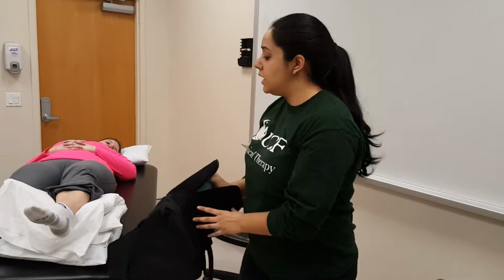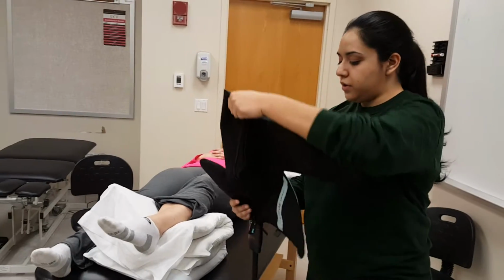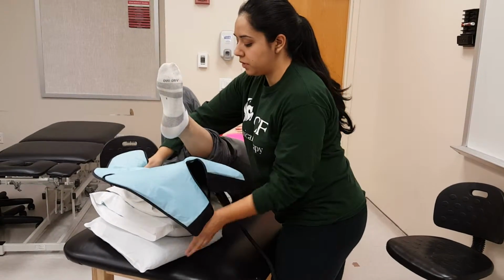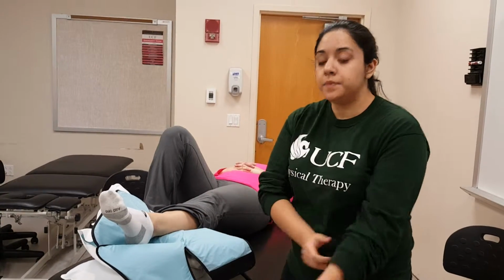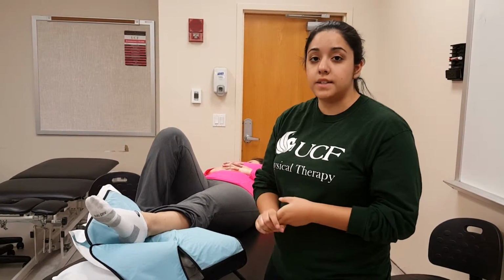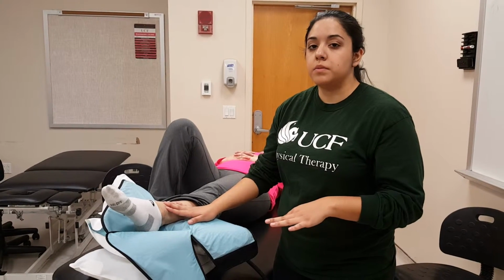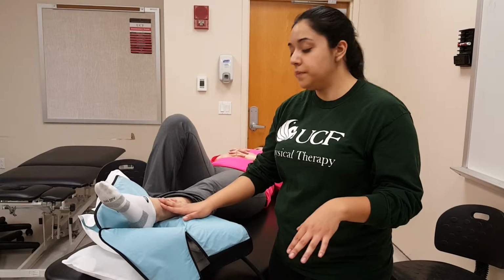We have our patient supine with her leg elevated. And for her ankle, we would just put it like this. And then first, before using any cryotherapy, we would assess the patient's skin for temperature, color, and sensation. So she's going to be a little warm because she's swollen, but we would only be concerned if the patient had cold skin, because then it would mean that they would probably have poor circulation to the area.